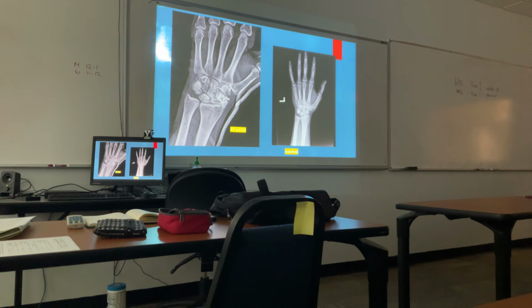Now we'll go into more detail about that when we get to semester 8, but right now, that's how that information gets used. You know how to do a wrist examination. You know how to do a follow-up with the wrist examination. Back in the old days, we had to decide, okay, the cast adds some dimension to it. Now, instead of saying this is a small body part in the digital world, you make it a medium one, and you'll get an x-ray that looks just as good as this.